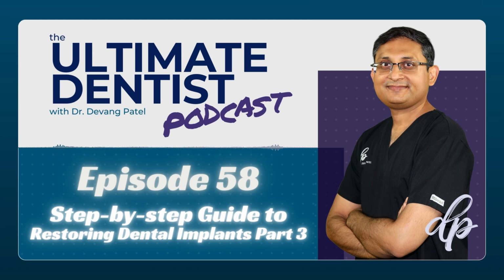As I said, with a cement retained crown, when you receive it from the laboratory, you will have a jig which will help you put the abutment into the right place, because the abutment can go into, depending on the implant, between 4 to 8 different positions. So your technician would have given you some sort of jig so that you know exactly what position the abutment needs to go in. You then torque the abutment in and then you cement the crown in.